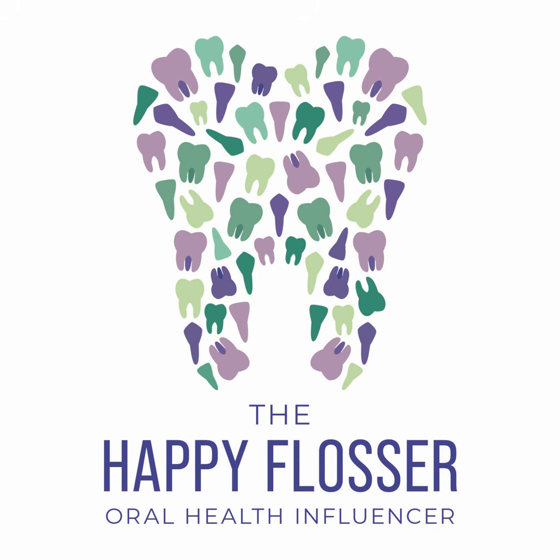And things where there's bone are going to be lighter. They're not going to be as dark because less radiation can get through that bone because of the density. The metal will not allow the radiation to penetrate through, so it does not reach the sensor. So that is why that shows up as white.